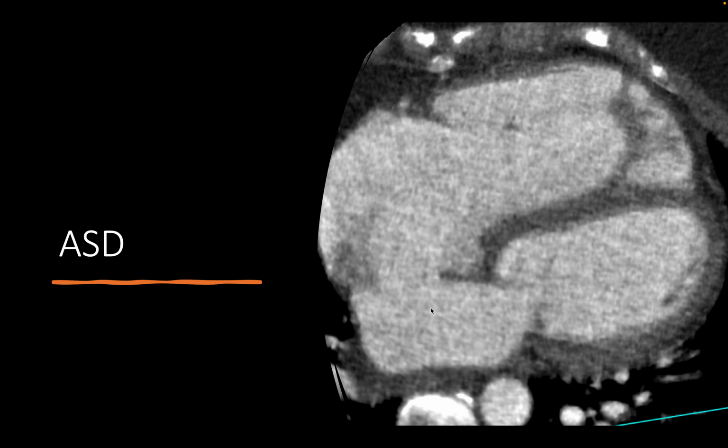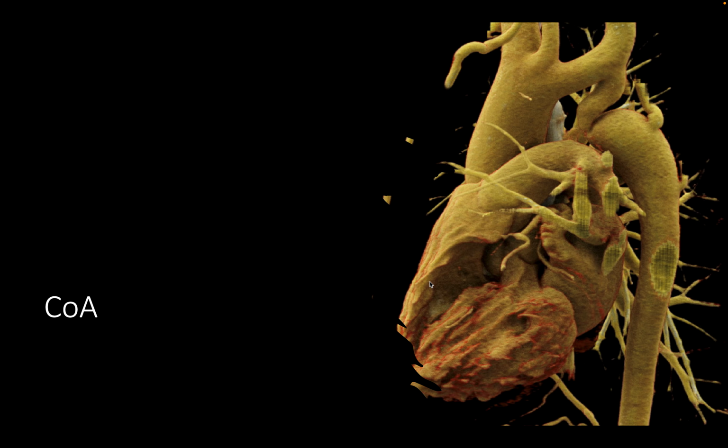For example, in ASD, that is a simple congenital anomaly. It could see the size, it could detect the anomaly, it could tell the right atrial dilatation, right ventricular dilatation, and it could guide whether that could be closed percutaneously or surgically by detecting the size of the rims, whether it's suitable for an occluder or not.